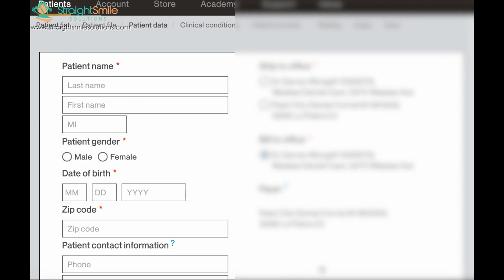One of the biggest mistakes that I see doctors make is that they get super stressed out. A long time ago when we first started Invisalign, our treatment territory manager, or whatever we called them, reps, would come help us set up our portal. That's not something that happens anymore. So you're pretty much on your own. Sometimes they'll have someone help you, like an international doctor, but from what I've seen, they don't do a good job at setting it up. So if you're interested in having help with your portal setup, we can do this as just a one-time meeting, very small fee for that.